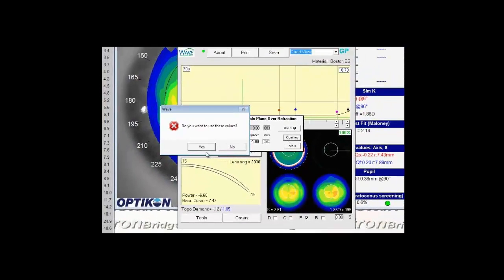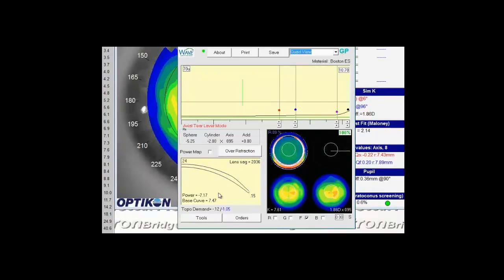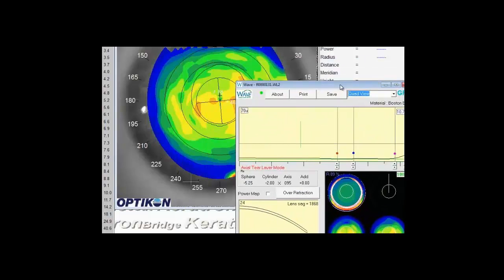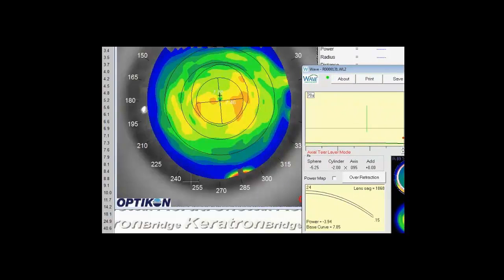You'll be prompted if you want to use the values, select yes. One thing you'll note is the thickness of the lens was increased immediately and if you watch the profile as I spin around, you'll see the inferior portion of the lens is much thicker than the superior portion. That's the front surface prism orientating the contact lens.